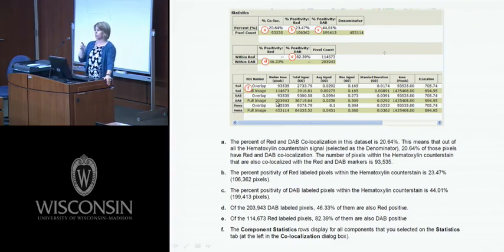So if you select your region of interest versus the whole image, it will tell you how many pixels. In the case of a chromogen, it will tell you the optical density, the total signal is printed out here. It will give you an average signal, the max signal, the standard deviation, etc.